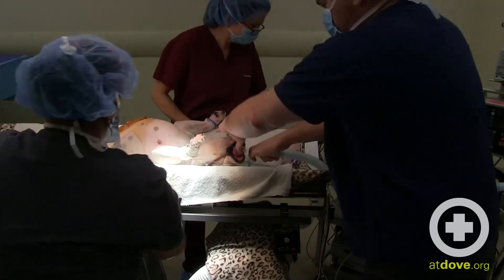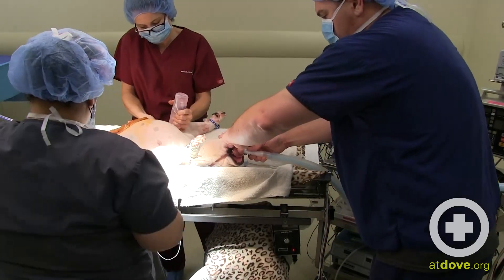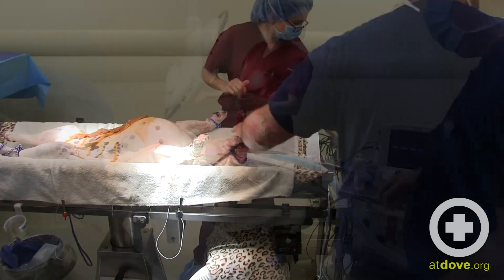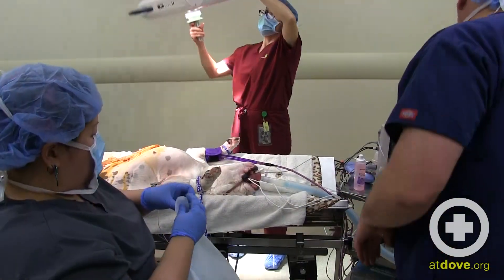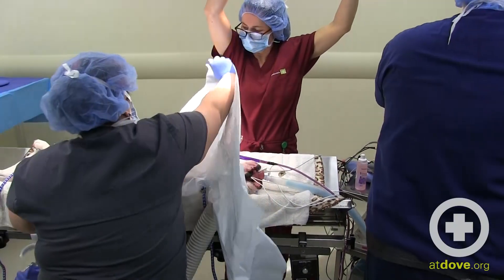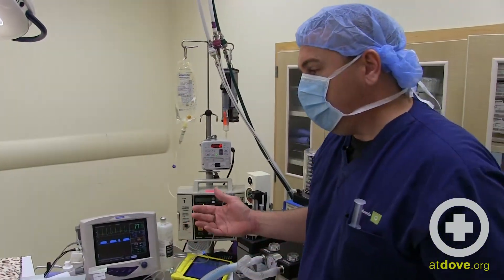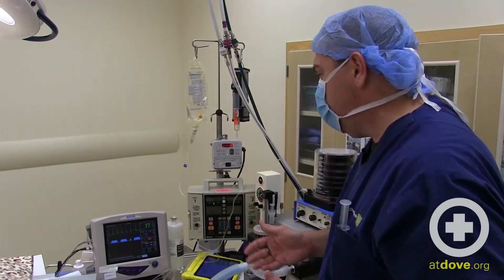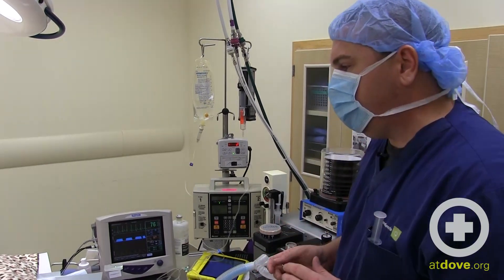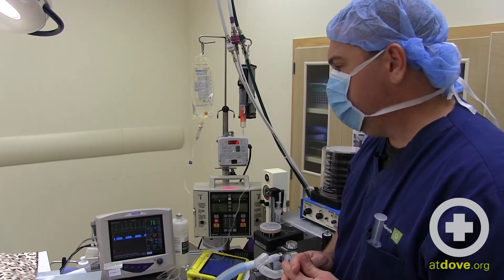The first thing we'll do is hook her back up to her breathing system so she can get some more isoflurane and stay asleep. Monitoring equipment is on next, then get our fluids going again. Our patient is now hooked up to monitoring equipment, fluids and CRI, and the ventilator — she is ready to go to surgery.